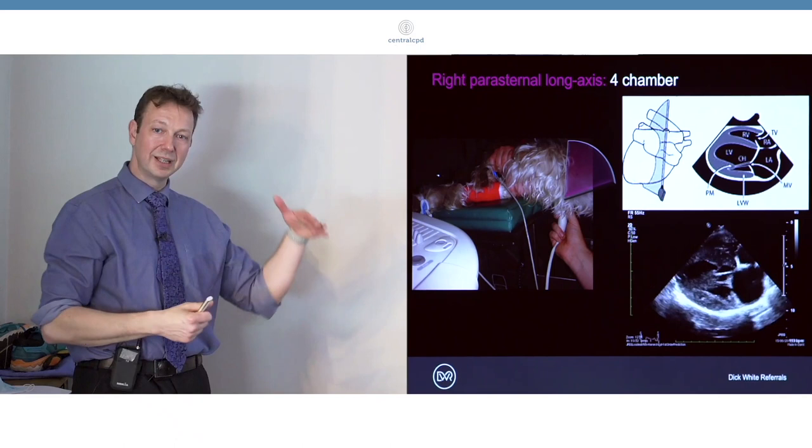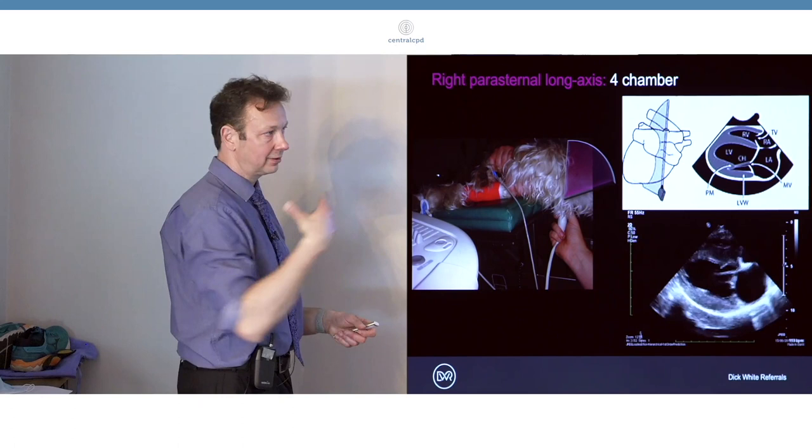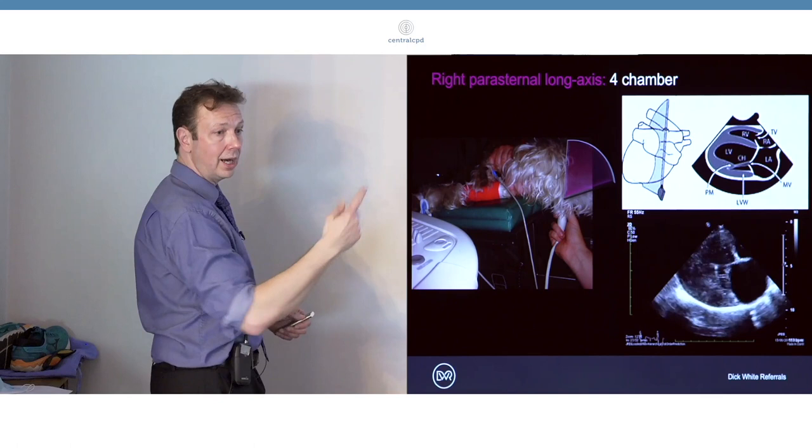We start off around about the third-fourth intercostal space, a good starting point to feel where the apex impulse is most intense, and start there and point up towards the lumbar spine.